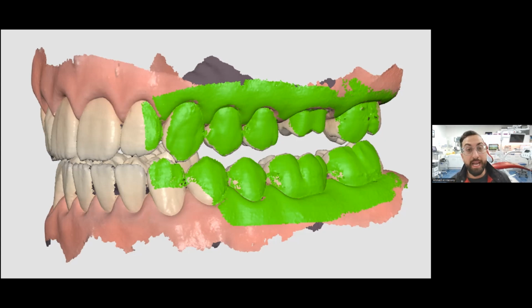I really don't like that technique because if you think about it, put a scanner in your cheek and it's really uncomfortable. You can't really get your normal bite that easily because you're kind of worried about biting on this thing in your mouth. So I prefer to tell the patients to bite down nice and hard. And then I retract the cheek with a mirror or my finger and then move the scanner into place. And I always tell them to bite really nice and hard and remind them to keep biting on their back teeth. You don't want a chewing motion. You don't want anything like that. Just biting nice and hard.